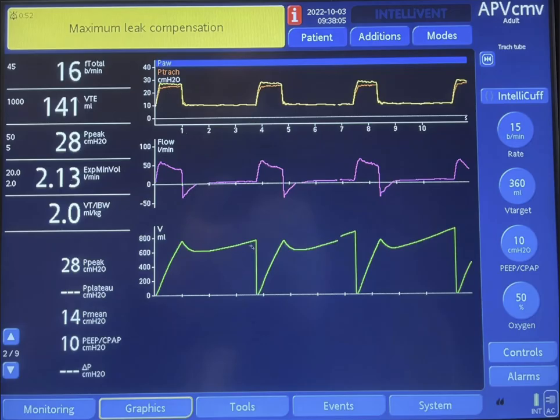At end of expiration, the volume does not go down to zero. Therefore, the machine will recalibrate and the volume goes down to zero before the next breath. Then the same thing happens again.